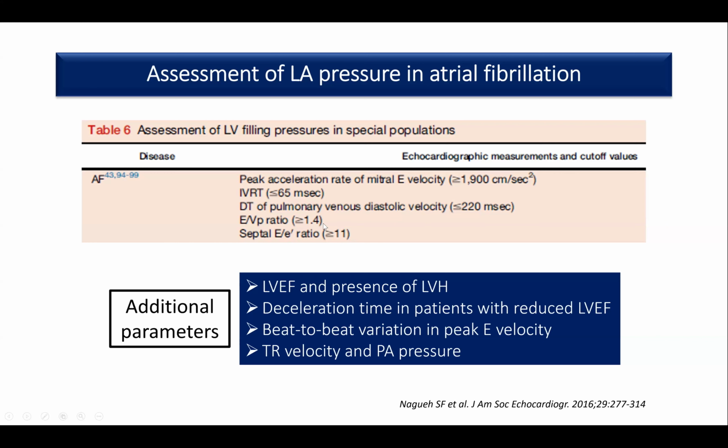E over Vp ratio is quite useful, but I think what's important is looking at the E/e' ratio, and here they say septal more than or equal to 11. If that's the case, that implies that the LA pressure is high.